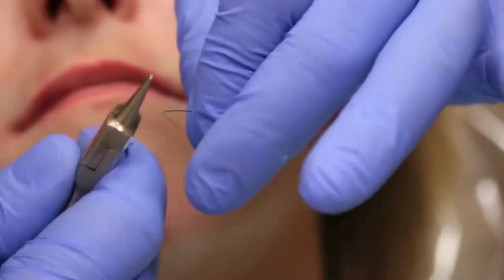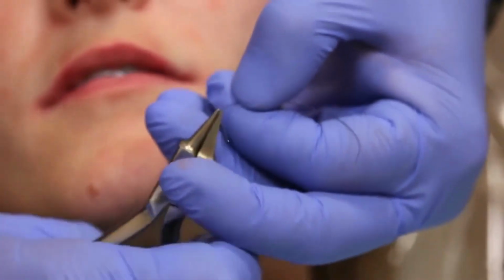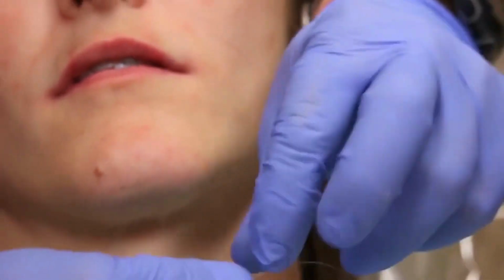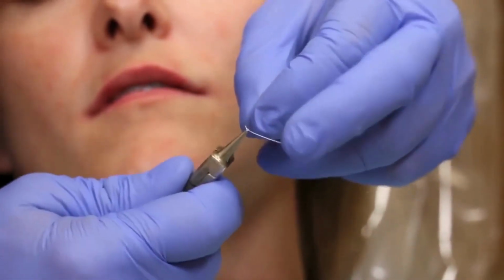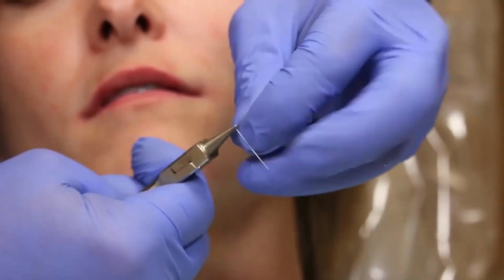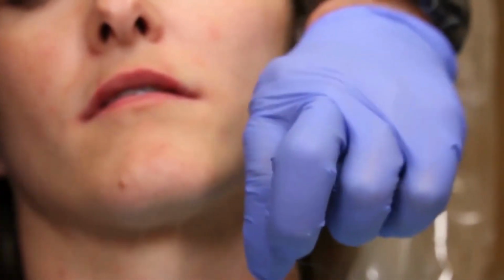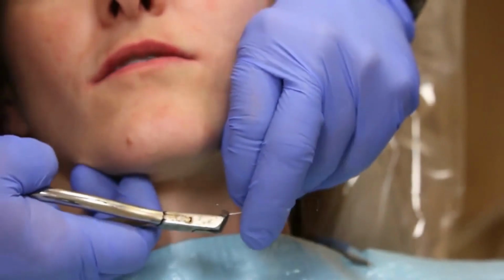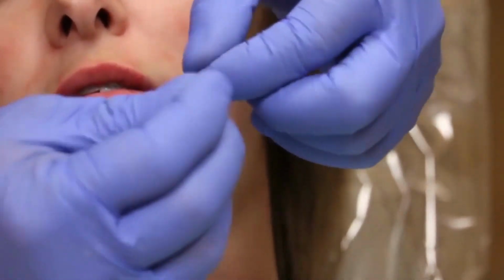So you want to turn your plier about 180 degrees. You just want to turn it, and that will give you a little 90-degree bend, so the patient will be more comfortable and the wire will not be sticking out, cutting her face or her cheeks. So you can see the little bend. And we do the same thing on the opposite side.